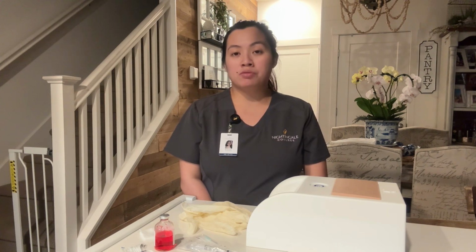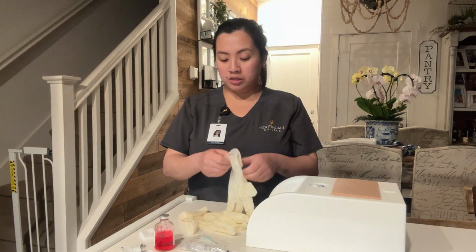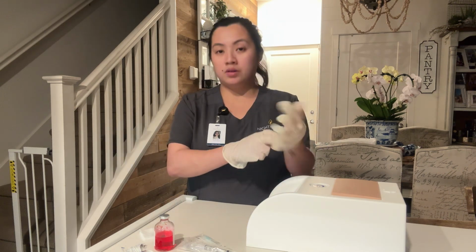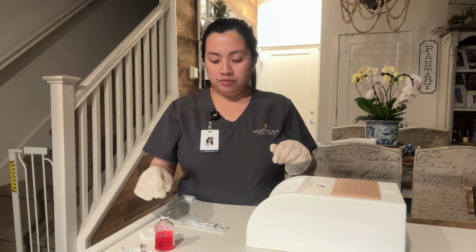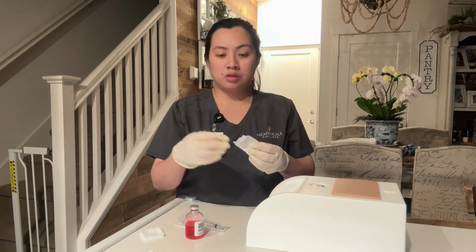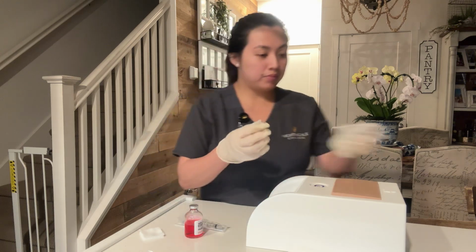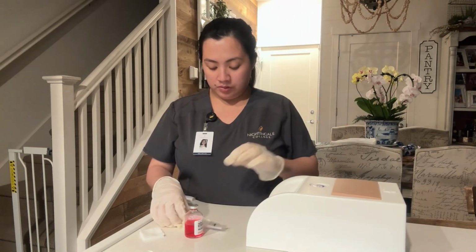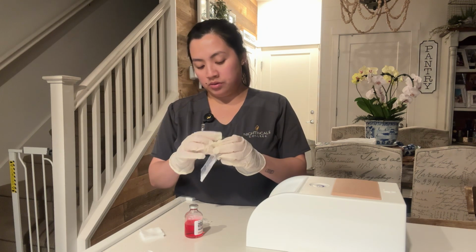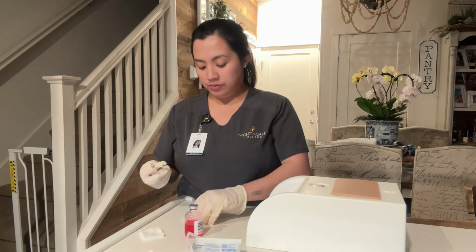Do you have any questions before I begin? Perfect. So I'm going to perform hand hygiene and put on some gloves. Okay. So now I'm going to verify the correct medication, and then I will clean the vial's rubber top with an alcohol prep pad. And then I'm going to get my syringe. I have a 3 ml syringe with a 25 gauge 1 inch needle.